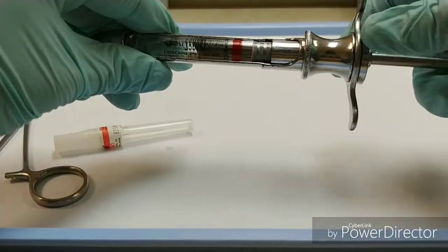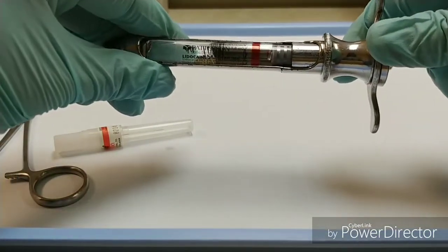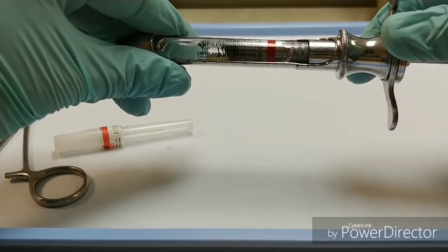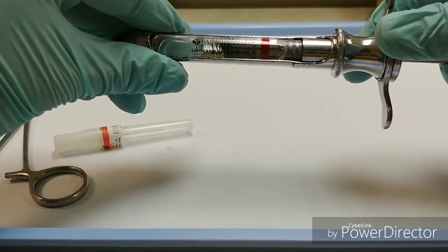Now I'll check that it's properly engaged by retracting that piston again. You should see kind of what I'm seeing here, where that cartridge can move along with the piston.